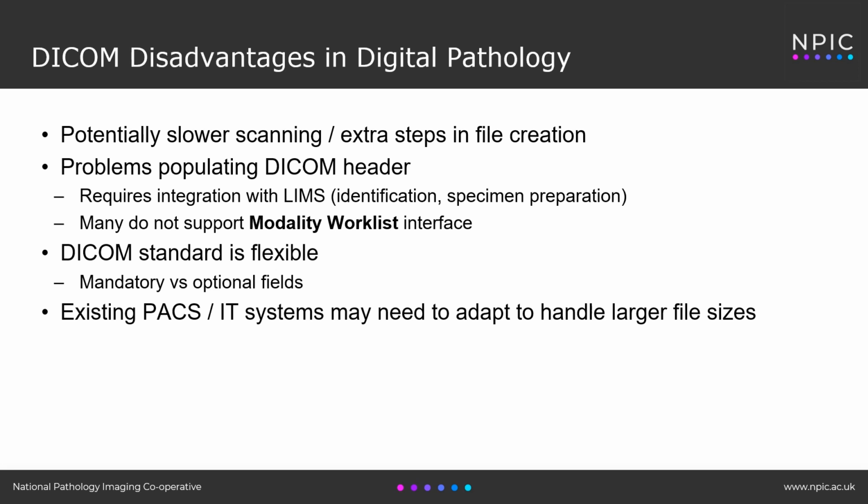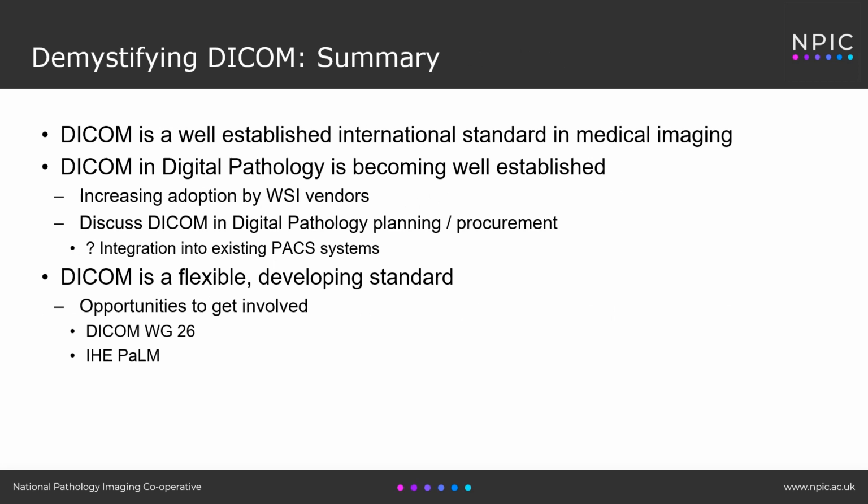The next was listed as an advantage, but it could also be considered as a disadvantage. The fact that the DICOM standard is flexible may lead to issues in terms of which are mandatory and which are optional fields, and how these are populated and which must be populated. Could cause issues and confusion further down the line. And lastly, if existing PACS or IT systems are being utilised for digital pathology, they may need to adapt to handle the larger file sizes compared with radiology.